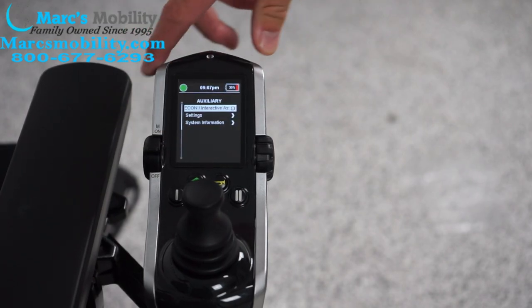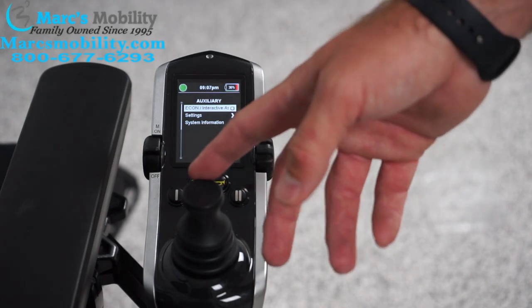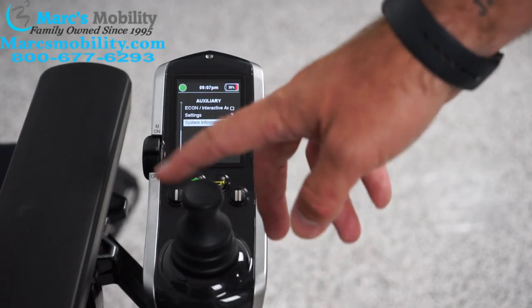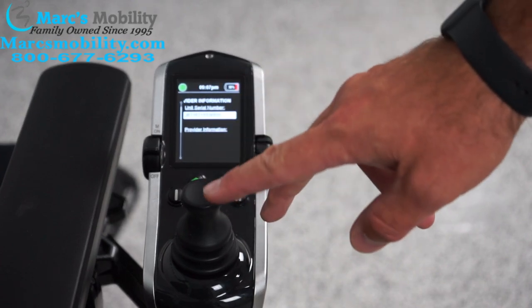If you push the lever forward again, it gets into some different types of settings. In here you can go down to system information and provider information, and your serial number is located right there.